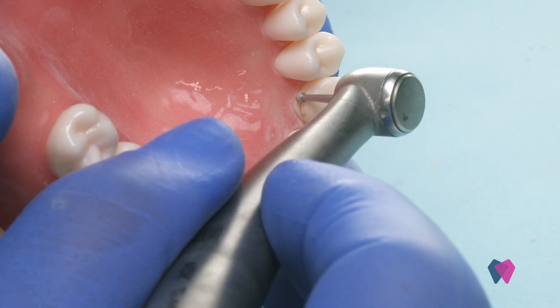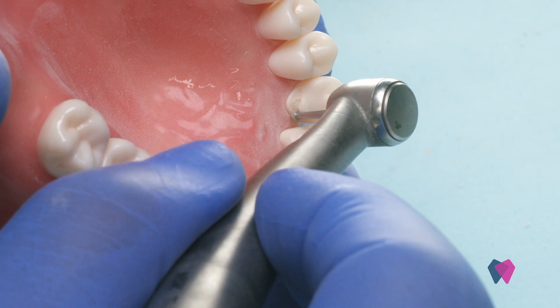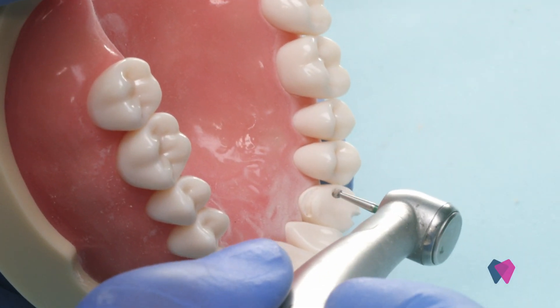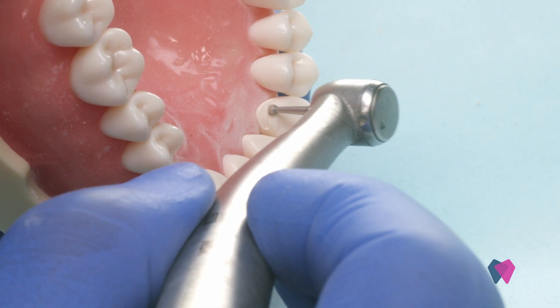I'm going to do that same depth cut on the lingual surface. The key here is make sure you go up the lingual to get a depth cut there as well.